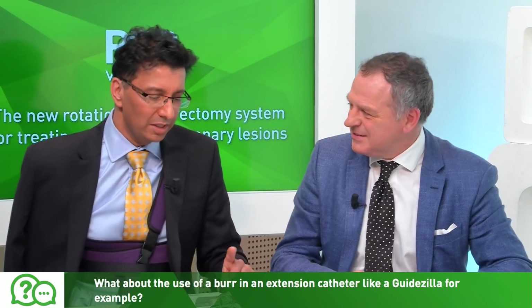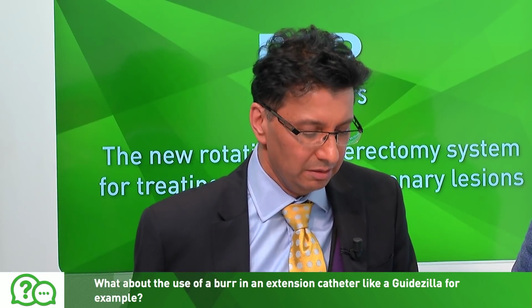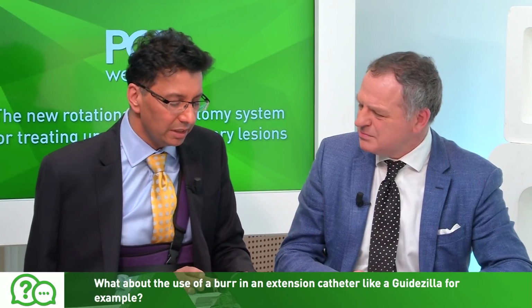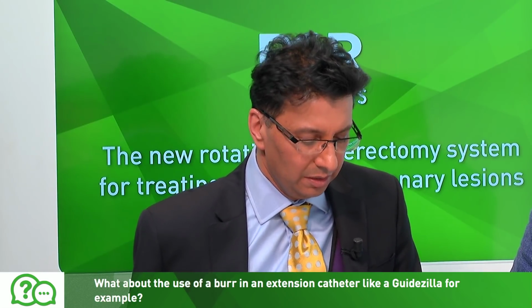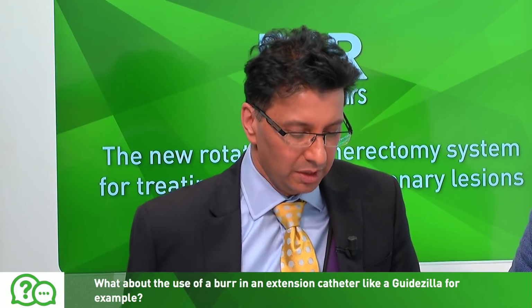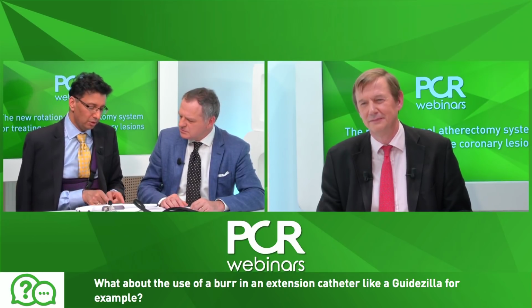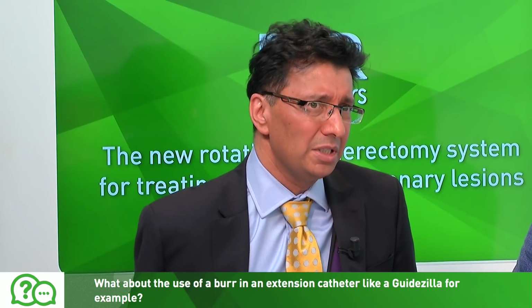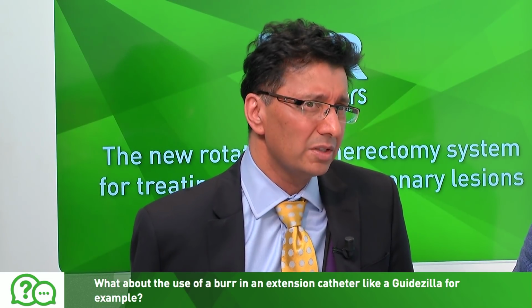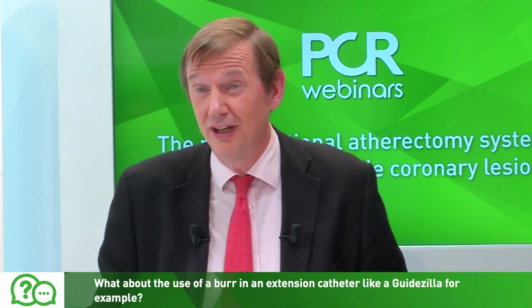And Bruno, if I can just come in on there. If I understand the question, what they're suggesting is that you basically are increasing the length of lesion that you can treat. But actually, there is another technique for doing that too. It's an advanced technique, but basically you lock the burr in a back location and then activate the burr, disengaging the internal brake and pushing the whole system forward, so that you now adopt a new run length. That's actually the technique that I use, and it obviates the need for using other guide support catheters. So that's the technique that I personally use. Yes, and with the smaller burrs, it's much less likely to cause any trauma with that.